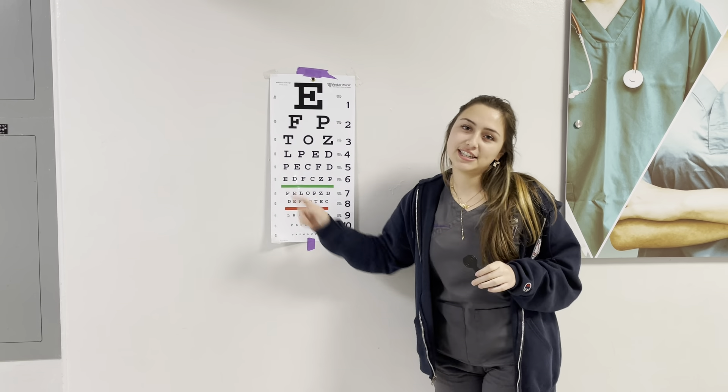Thank you. At this moment, you're going to ask your patient to step out so you can document it. In my case, my patient for both left and right eyes got a 20 over 40, and then for both eyes got a 20 over 50.